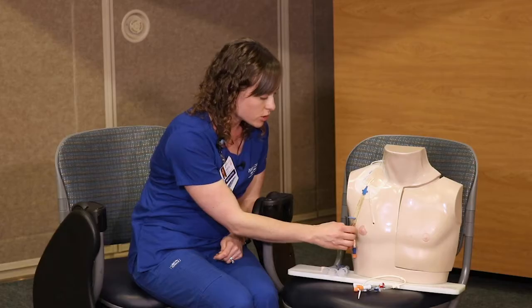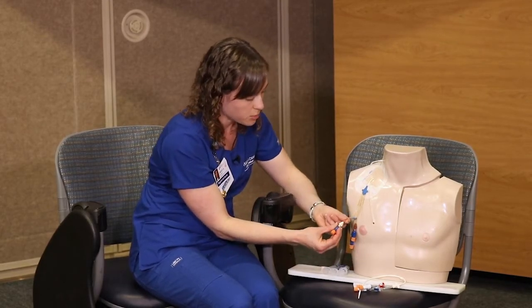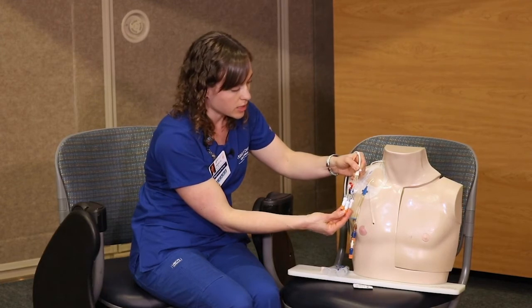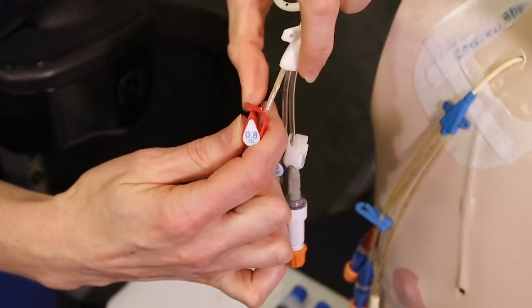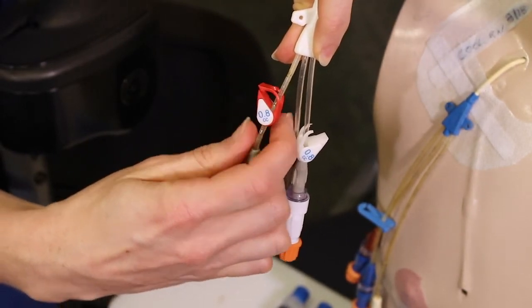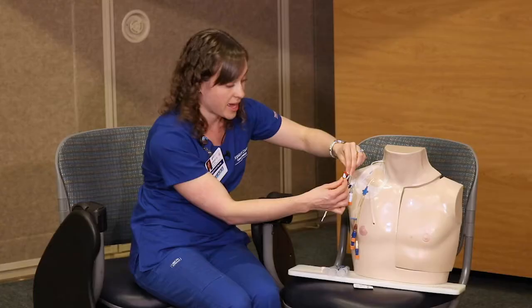When you go to flush the lumens with the heparin, these lines don't have any type of locking device on them. This Trifusion is similar to what you might be using at home. These little clips unclip here and make a snapping sound so you know that it's open. Once you're finished flushing, you'll just close it again.